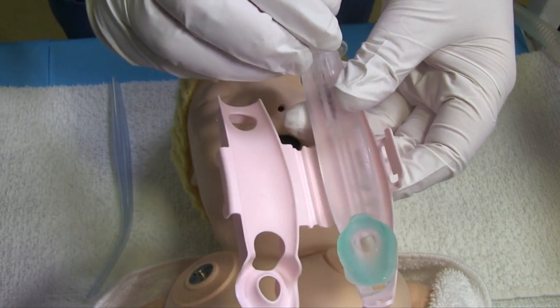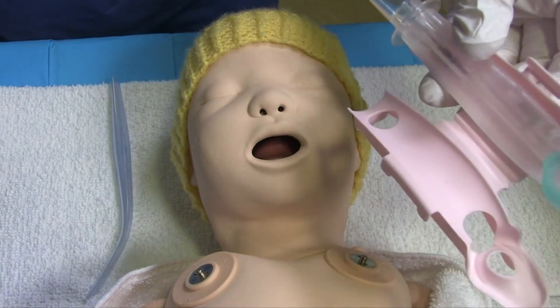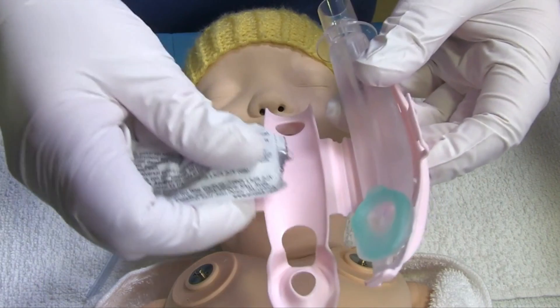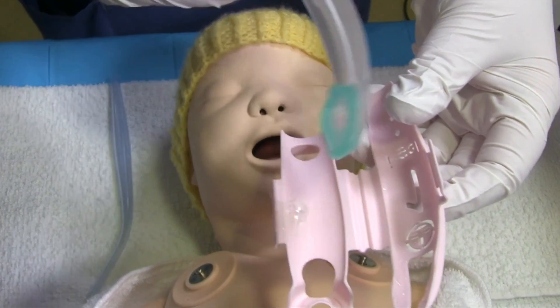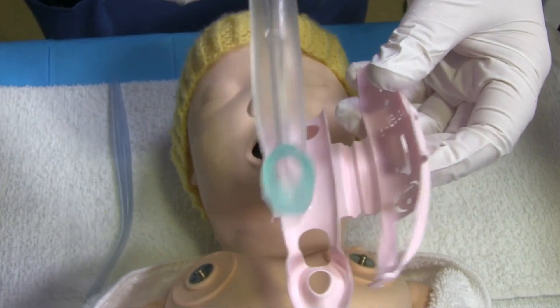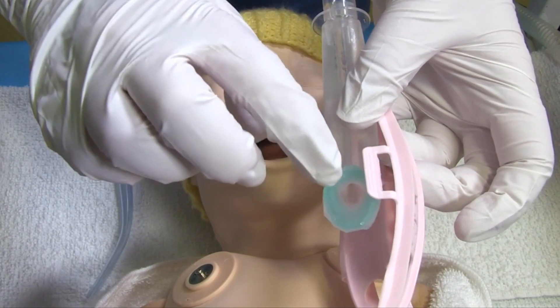Prior to insertion you need to lubricate the iGel. You can place some lubricant on the cradle of the iGel and then you want to lubricate both the sides and the back and the tip, but you do not want to occlude the lumen.